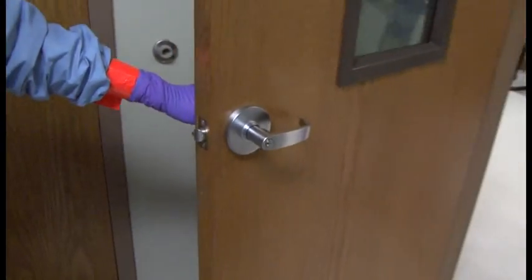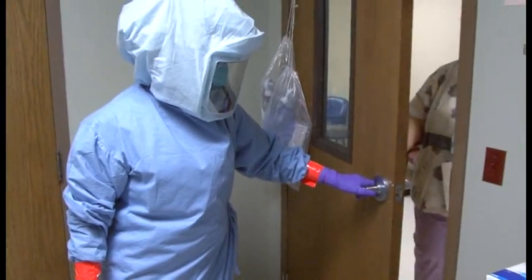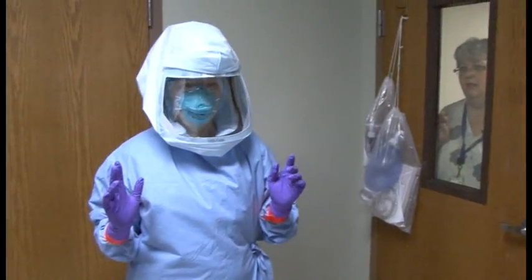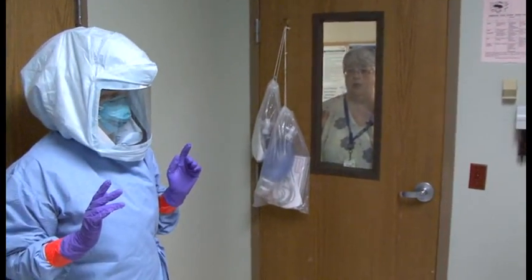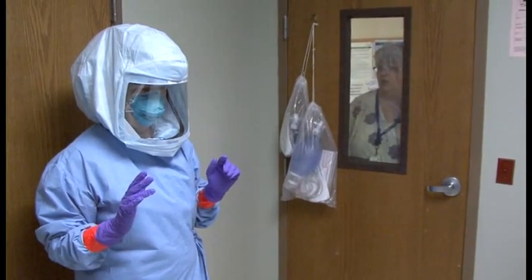Lynn has gone into the room and shut the door behind her to begin caring for the patient. The observer remains at the window, watching Lynn the entire time she is in the room, watching for any signs of PPE breach, and communicating by knocking on the window. If Lynn needs something, she can talk through the window because the observer can hear her.